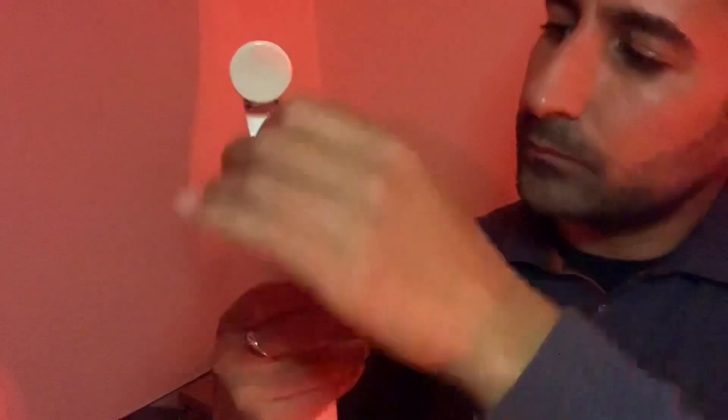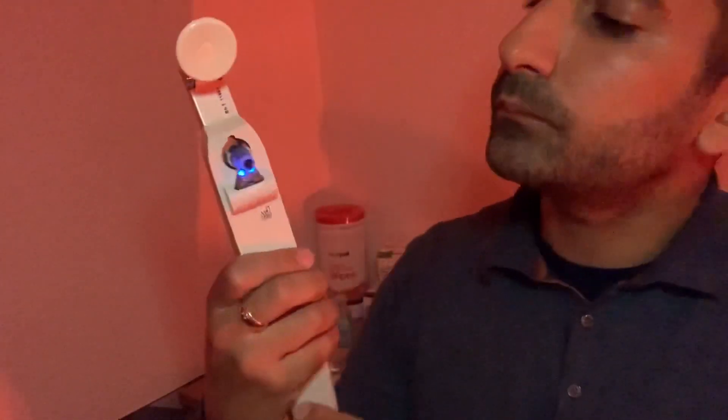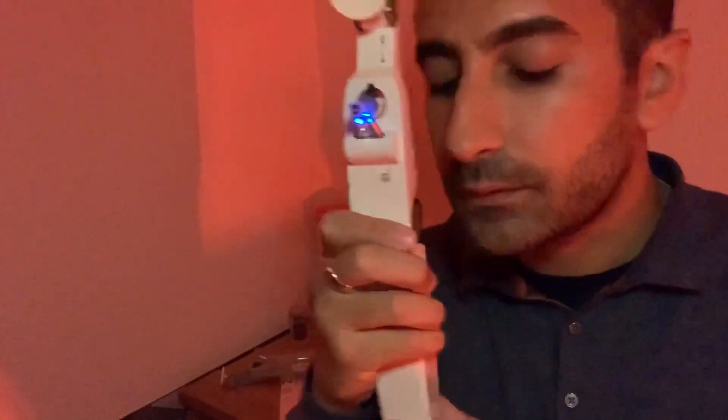Take a few blinks — I'm just going to make a few pre-checks. Excellent. So before the probe touches the front of the eye, it's important to know that you have to breathe normally, keep both eyes open at all times, and just try and relax. The drops will have worked on the cornea now and you shouldn't feel any pain or discomfort whatsoever.